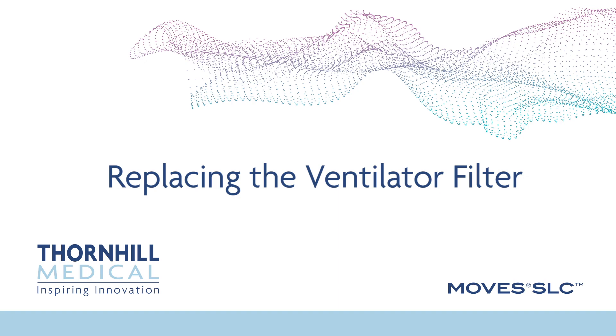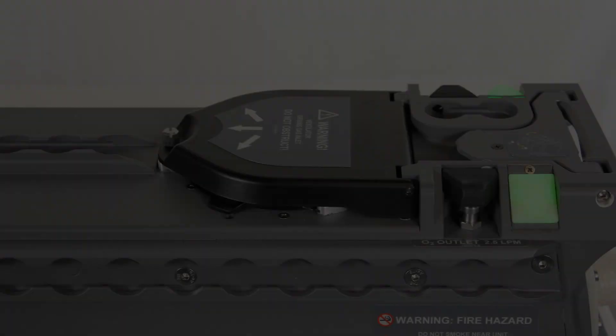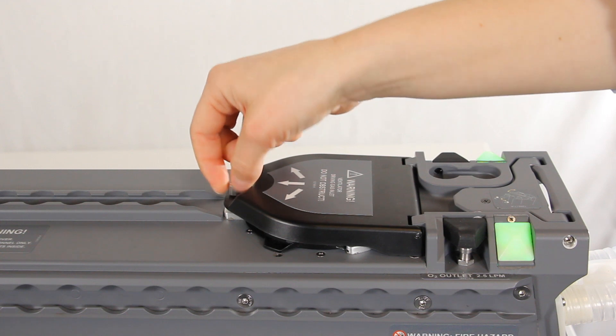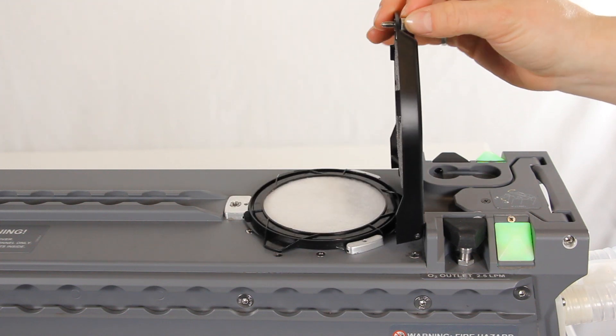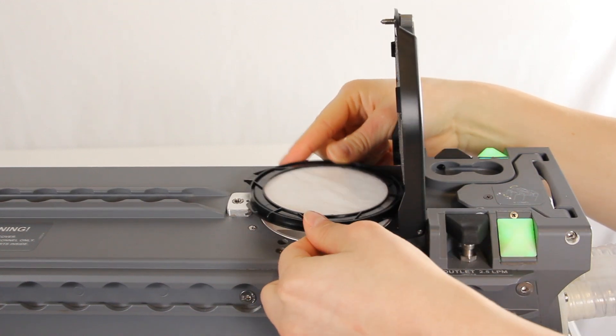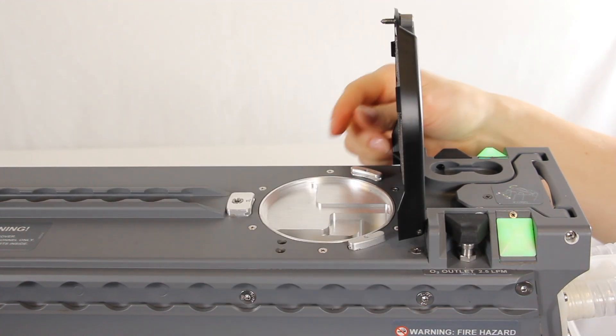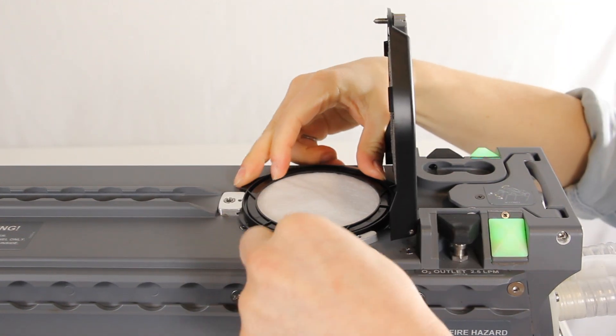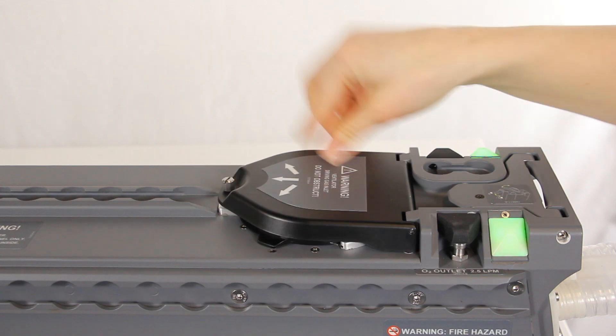Replacing the ventilator filter. The ventilator filter is a user serviceable component that must be periodically replaced if it becomes damaged or compromised, or as indicated in the operator's manual. Locate the ventilator filter cover on the MOVES SLC. Unscrew the thumbscrew and lift the ventilator filter cover. To remove the filter, press the filter frame down while turning it counterclockwise. Discard the filter in accordance with local regulations. Install a new filter by pressing the filter frame into place and turning it clockwise. Tighten the thumbscrew.